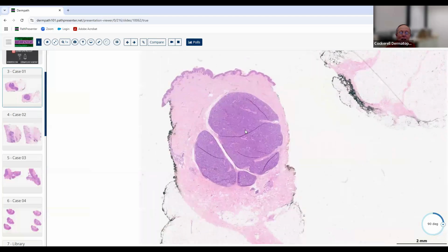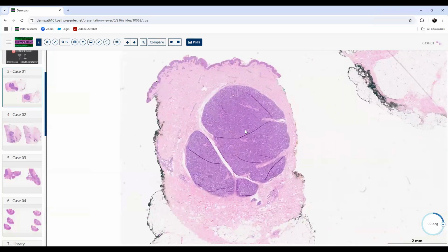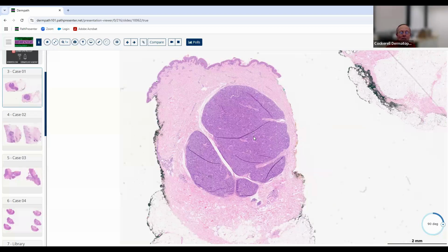Okay. So it looks like a punch. I'm favoring neoplastic, but it looks benign to me. It's pretty well demarcated, like I could draw a line around it. The stroma looks relatively uniform throughout, and it's pretty symmetric in shape. So that's why I'm favoring benign. And those are all exactly good reasons for favoring benign.